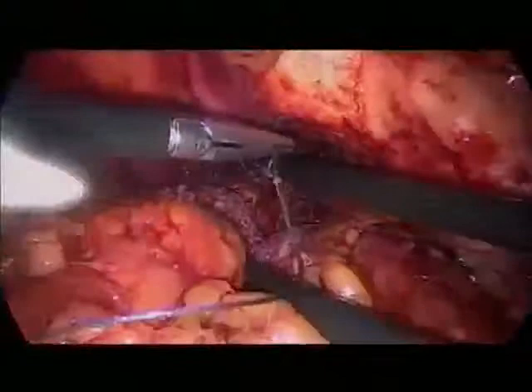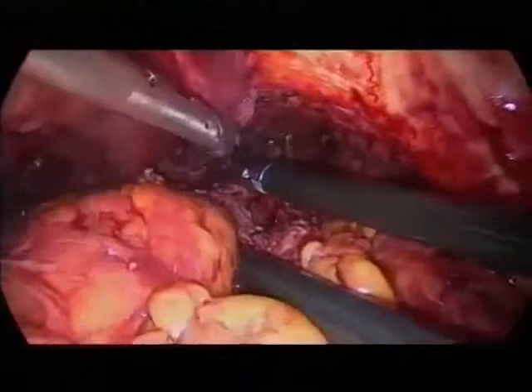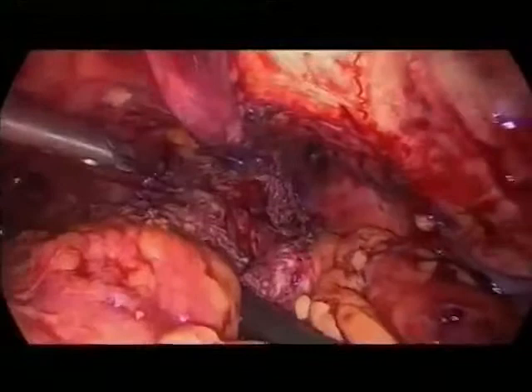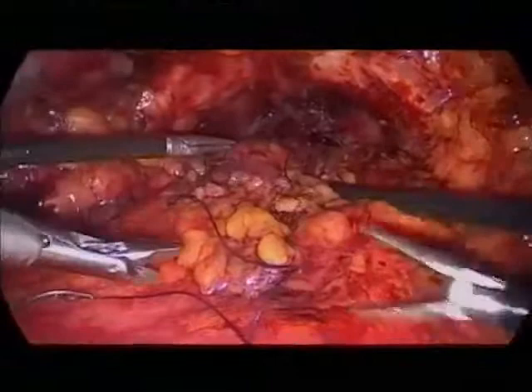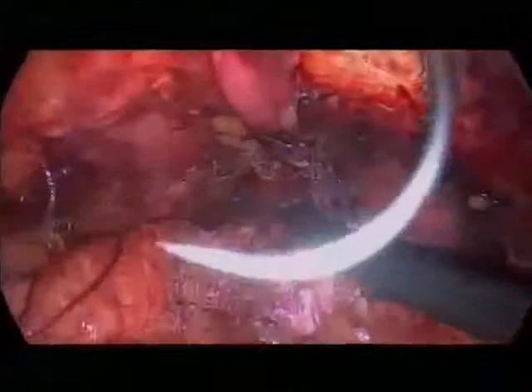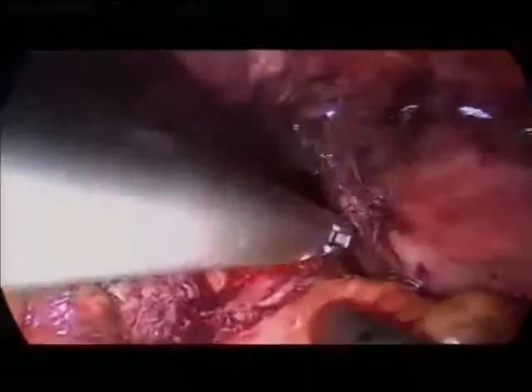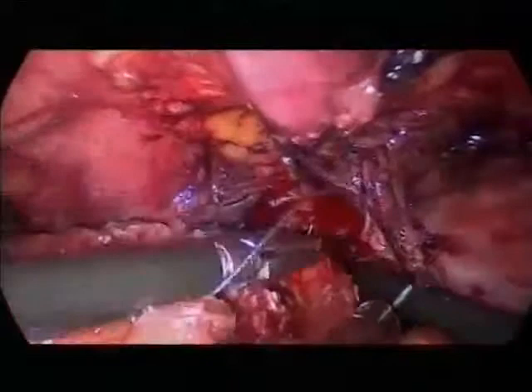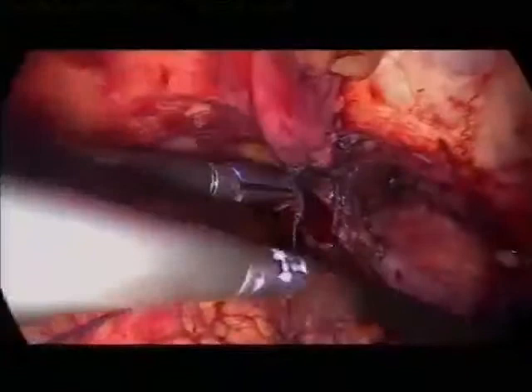We have a fat tissue, so there is no real risk. But why don't you think you could put a bigger clip here to speed up the procedure? Because we have a small vessel. You see, I cut the Denonvilliers fascia to find the fat tissue. Yeah, but you are far away from the bundles now here, so I don't think that there is any risk of injuring the important structure. The prostate is somewhere. I'm pulling down. I want to show you if it's feasible.